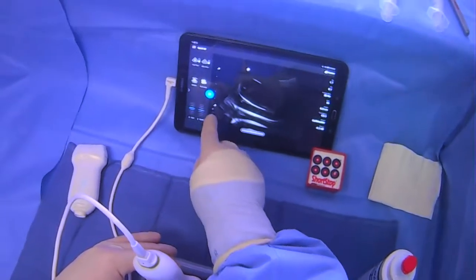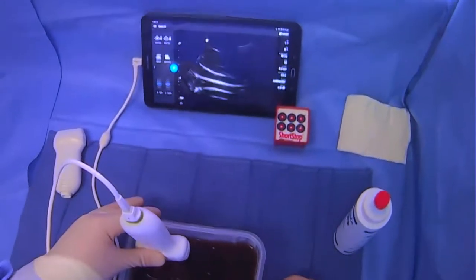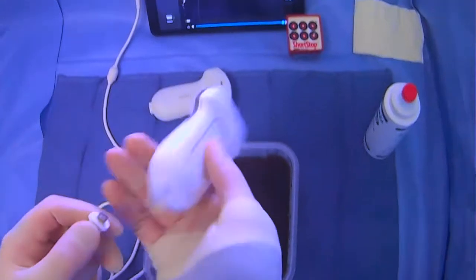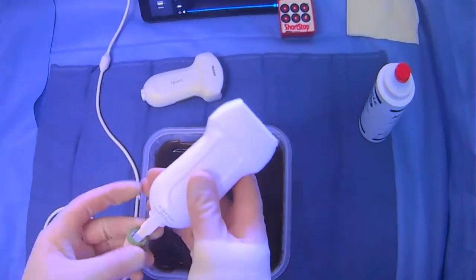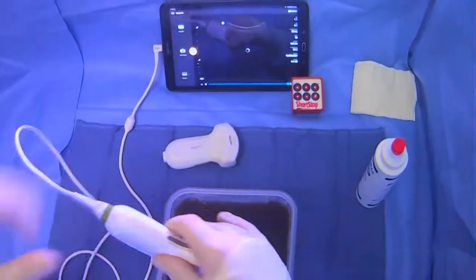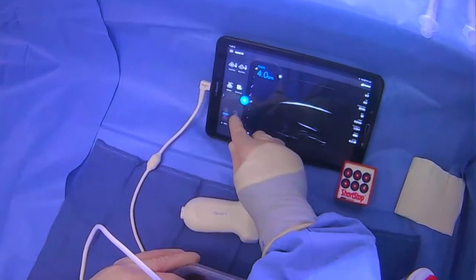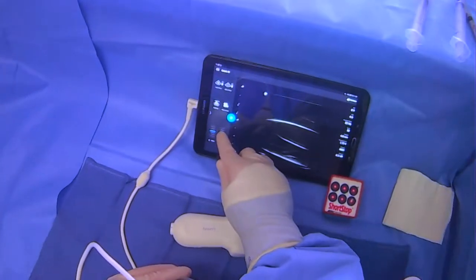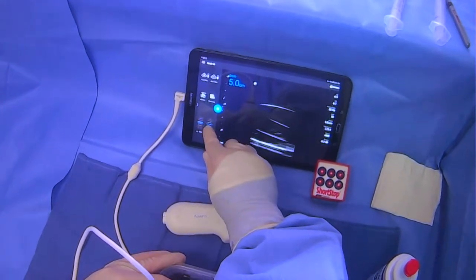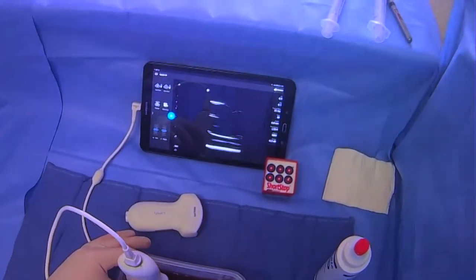Now that we see we're kind of dealing in the less than five centimeter range, we're going to switch over to the linear probe to get a little bit better resolution for this area. Using the curved probe is generally what you'll start with. However, if you have an opportunity to use the linear probe, it can be useful for more superficial collections, or if you have a patient that scans well and allows you to use the linear probe.